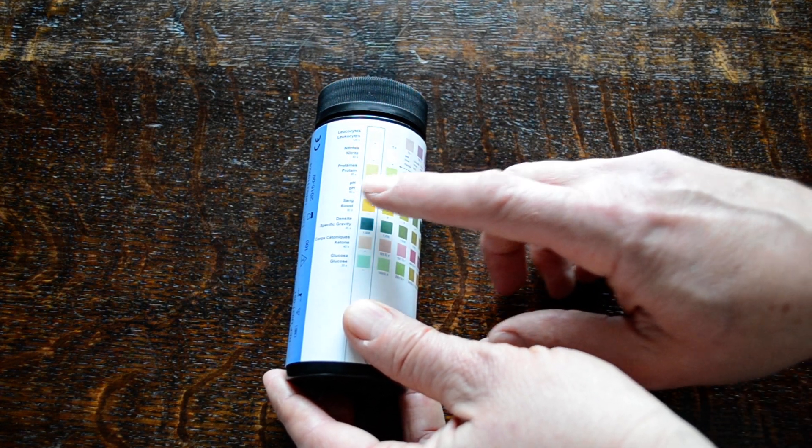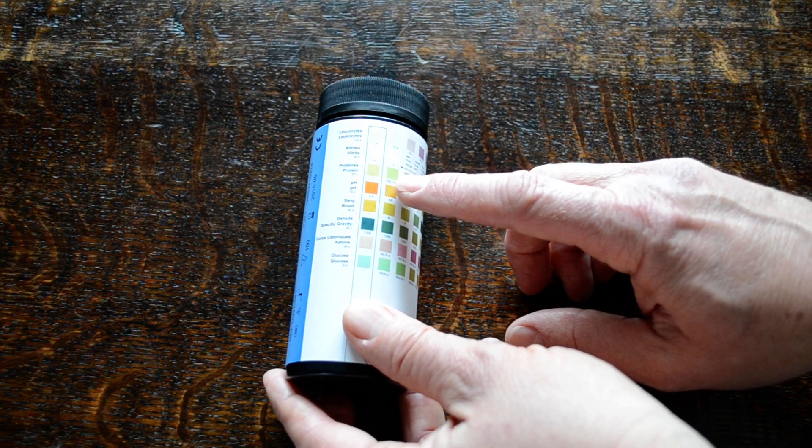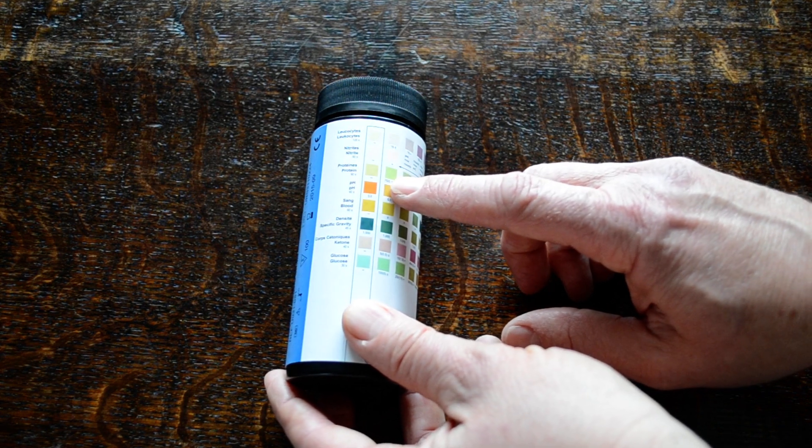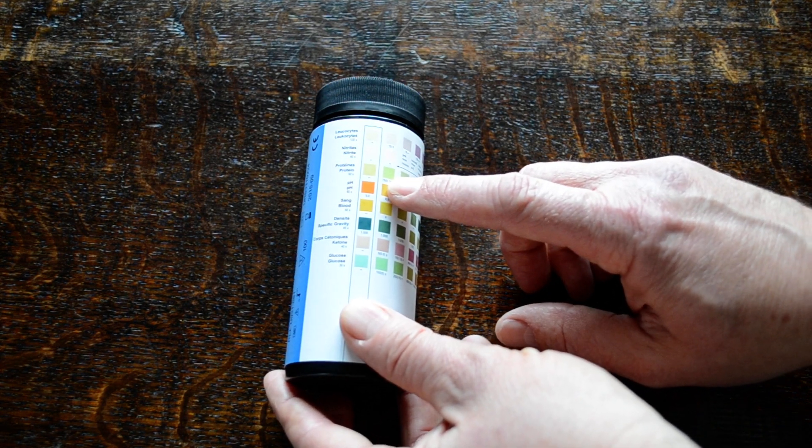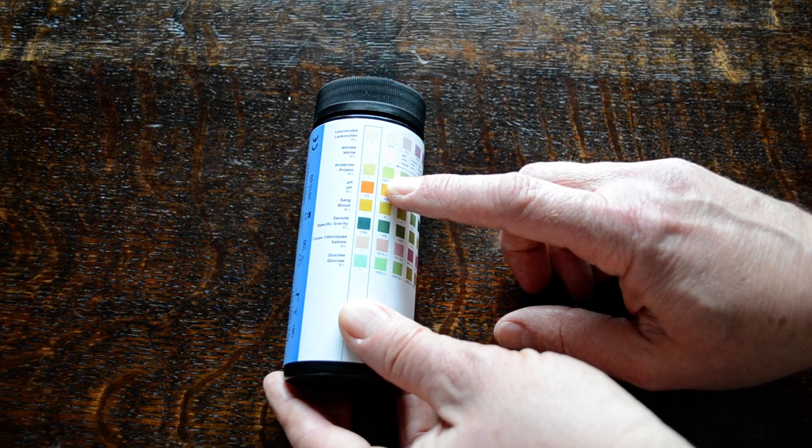We're also looking for the presence of protein, which again is an indicator marker of something going wrong with the renal tract.